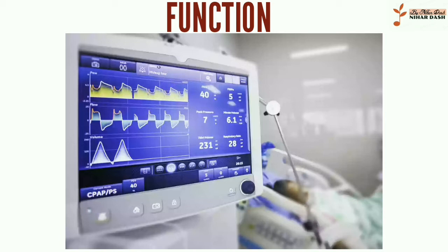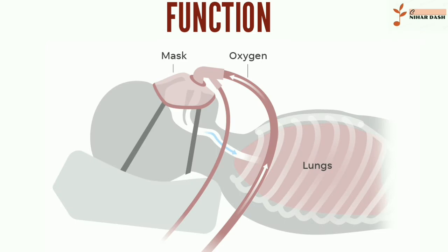Determined by the type of ventilation needed, the patient end of the circuit may be either non-invasive or invasive. Non-invasive methods, such as continuous positive airway pressure (CPAP) and non-invasive ventilation, which are adequate for patients who require a ventilator only while sleeping and resting, mainly employ a nasal mask. Invasive methods require intubation, which for long-term ventilator dependence will normally be a tracheotomy cannula, as this is much more comfortable and practical for long-term care than is larynx or nasal intubation.